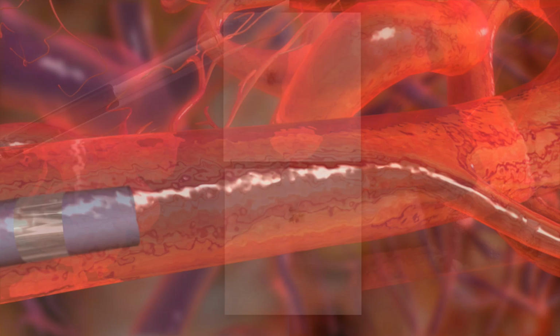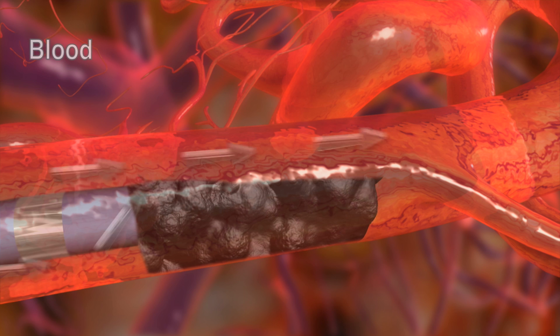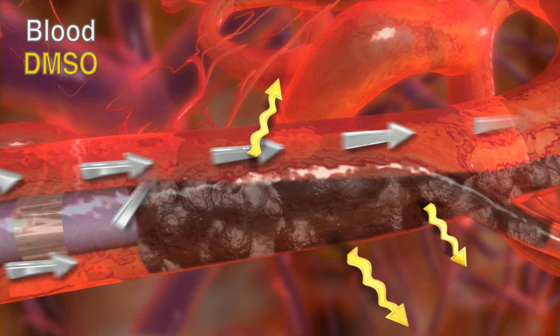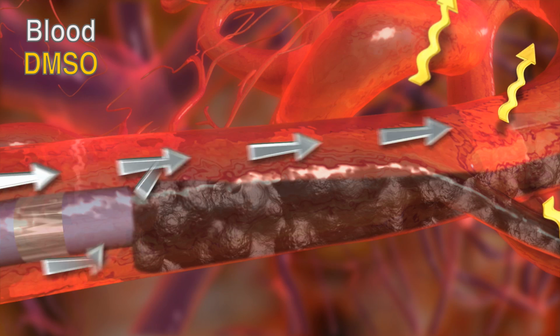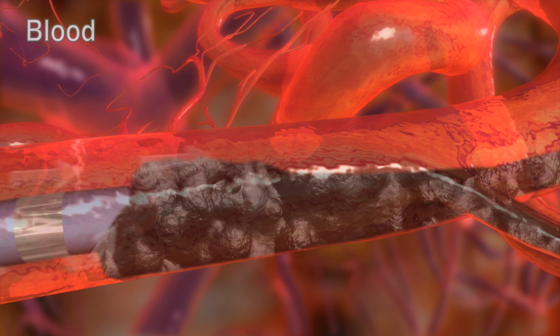ONYX advances because it is pushed, often compared to how lava flows. ONYX begins to solidify from the outside while the inner core remains liquid for a given duration. ONYX follows the path of least resistance. At times, flow dynamics within the nidus can make that path retrograde, causing the ONYX to reflux. During most ONYX procedures, reflux is likely to occur. As mentioned earlier, the amount of acceptable reflux should be determined in advance.